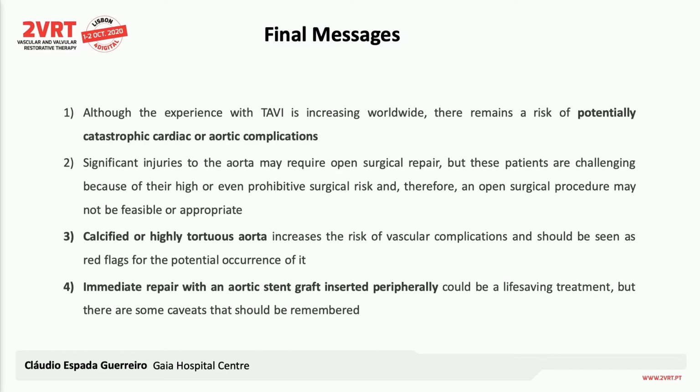So we have to think that probably, and we are looking now in retrospective, we could begin the procedure anticipating the difficulty in the crossing of the aortic isthmus with an extra stiff guide wire or a buddy wire or a buddy balloon. So another option could increase the support in the system delivery advancement.